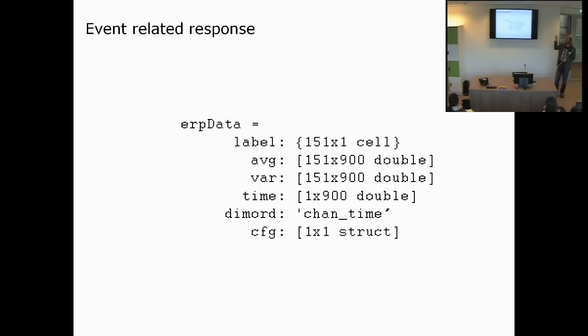For this one, it's not so difficult to see how the data is organized. But once you start working with time-varying multitaper spectral analysis, you end up with 4-dimensional, sometimes even 5-dimensional data structures. Then keeping track of what is represented in which dimension is quite important.